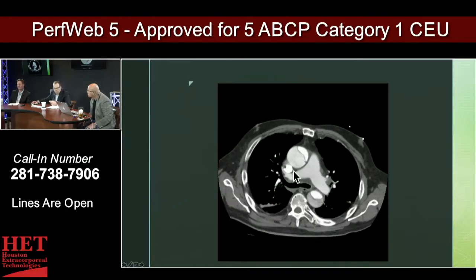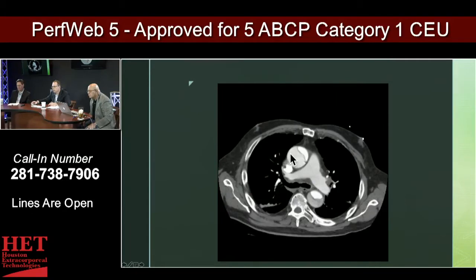The embolus is going to be dark on an angiogram study because the blood vessels are bright, the blood is bright, and any solid structure is going to be much darker — so you would be able to see the embolus there. This is the aorta — the ascending aorta heading towards the root, and this is going to be the descending aorta.